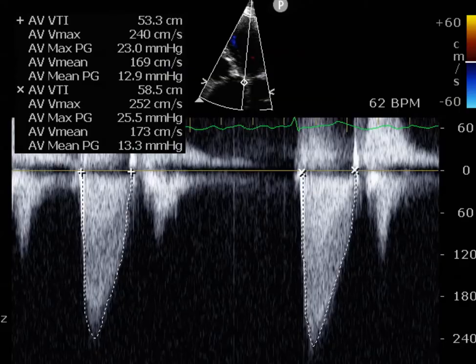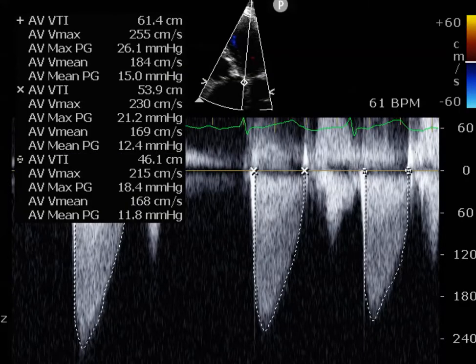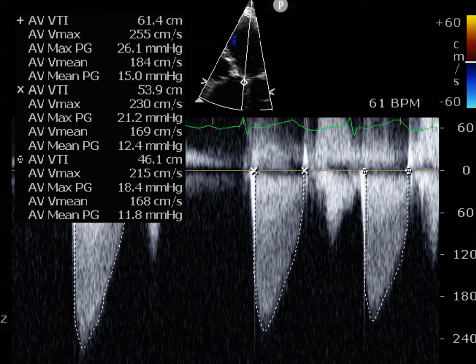The velocities obtained tended to be around the mild to moderate range. AVA came out to be about 1.1 and the mean gradient about 16, with a peak velocity of about 260 to 270 centimeters per second, which is consistent with mild to moderate — which I believe I called mild aortic stenosis.